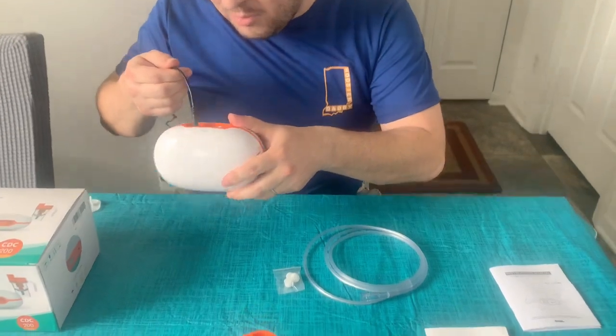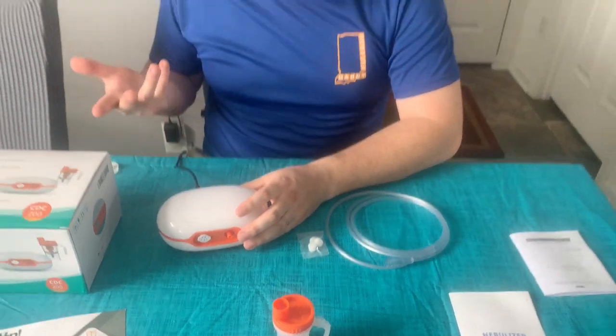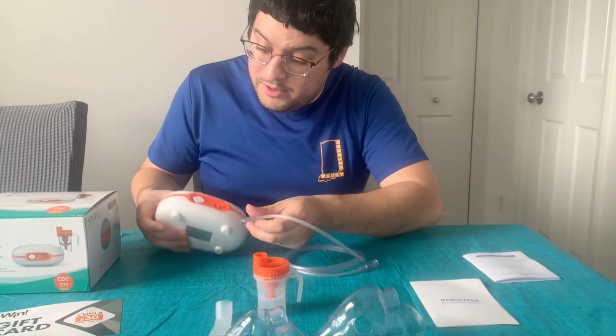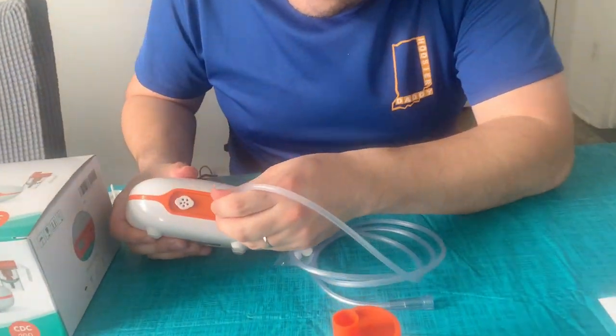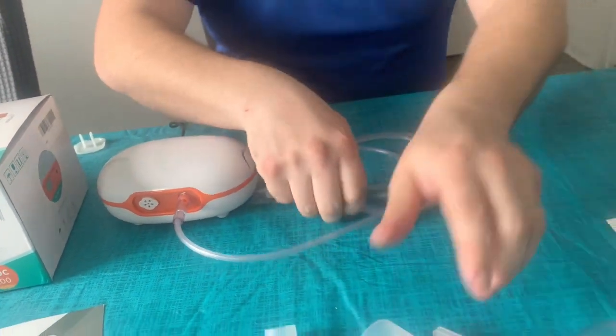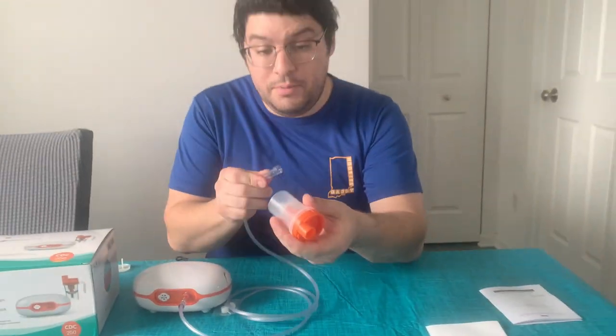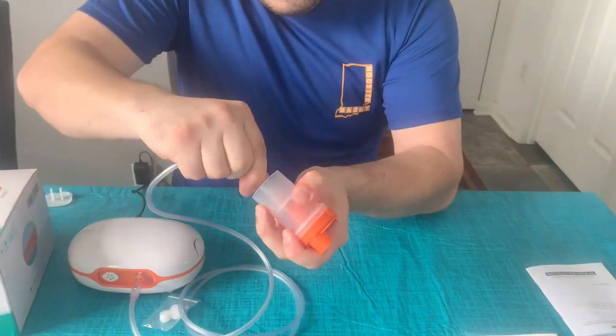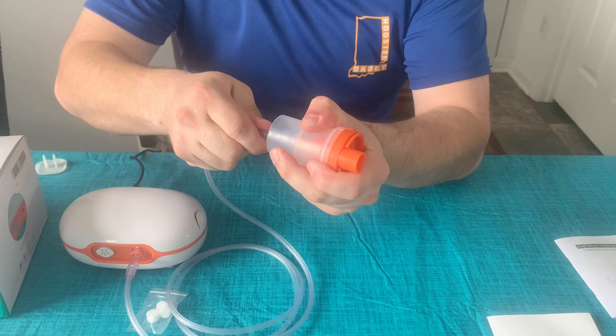First, I have it plugged into the wall here. If you need power, just plug it into the wall. We have our tubing here — we're going to attach that. Make sure it's tight. We have our liquid cup. Put that in the bottom and make sure that's nice and secure.